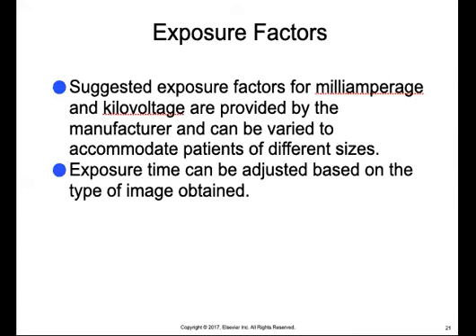The suggested exposure factors for milliamperage and kilovoltage are provided by the manufacturer and can be varied to accommodate patients of different sizes. So a patient that is a little bit smaller, like a small child, would use exposure factor settings that are less than a large patient, like a grown man, where the density of his bone and surrounding structures is going to be greater and thus require more milliamperage and or kilovoltage.